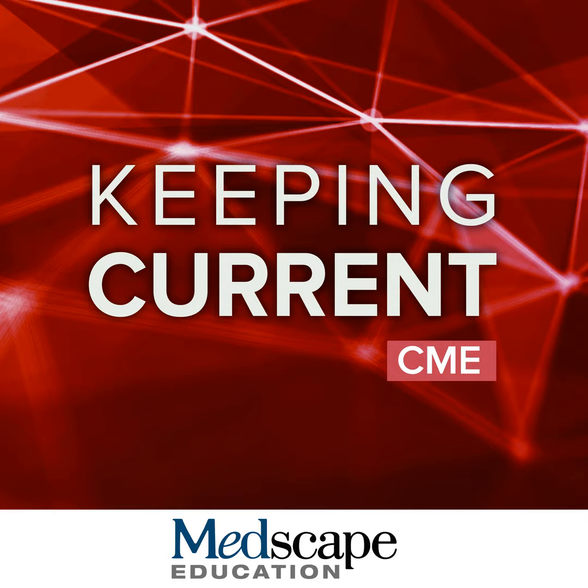So yeah, in the title, this is supposed to be metastatic disease, and so I am going to talk about metastatic disease too. What we know is that in a meta-analysis of diffusion-weighted imaging and gadoxetic acid-enhanced MRI, not AMRI, for the detection of liver metastases, diffusion-weighted MRI is less sensitive than gadoxetic acid-enhanced MRI, but when you add the two together, diffusion-weighted imaging and gadoxetic acid MRI is actually the best combination, and these results hold for colorectal metastases and also metastases that are less than 1 centimeter.